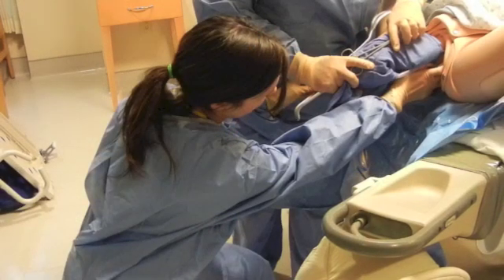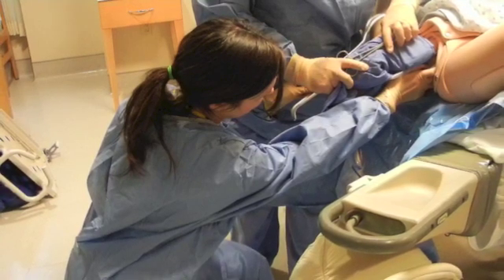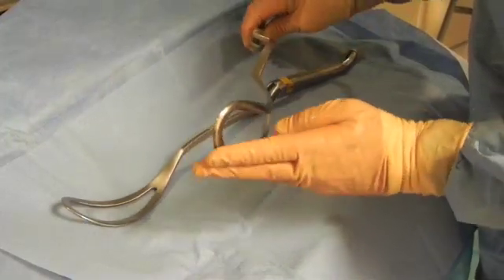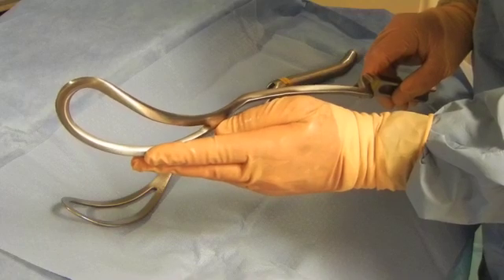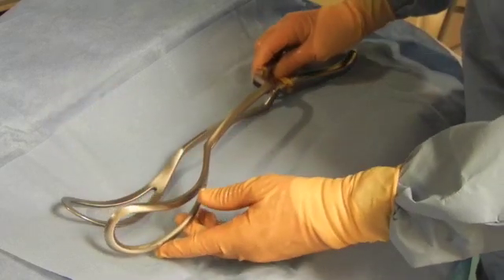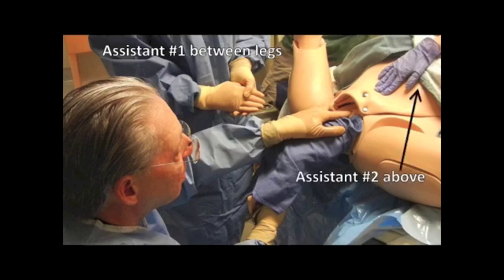The operator is usually in a very low position, kneeling on the floor or on an extraordinarily low stool, so that the blade is then directed upward and slid into position. To accomplish the delivery successfully, it is ideal to have an assistant between the legs and to have another assistant guiding the head down into the pelvis, following the head with manual pressure applied on the abdomen.